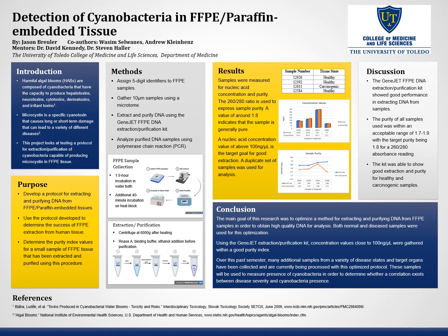Hello, my name is Jason Breuler, and today we'll be talking about the detection of cyanobacteria in formalin-fixed paraffin-embedded tissue, otherwise known as FFPE tissue.